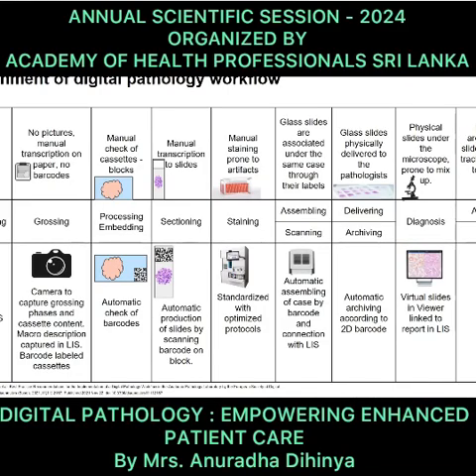And what is the benefit of it? When we are doing the tracking, the chain of custody is there. It means the right sample and the right slide preparation is handed over to the pathologist, and the right diagnosis goes to the patient. And along with digital pathology, it helps the pathologist, who can even work from home if they are not available on the hospital campus. They can remotely access via laptop or mobile, and it becomes very easy for them.